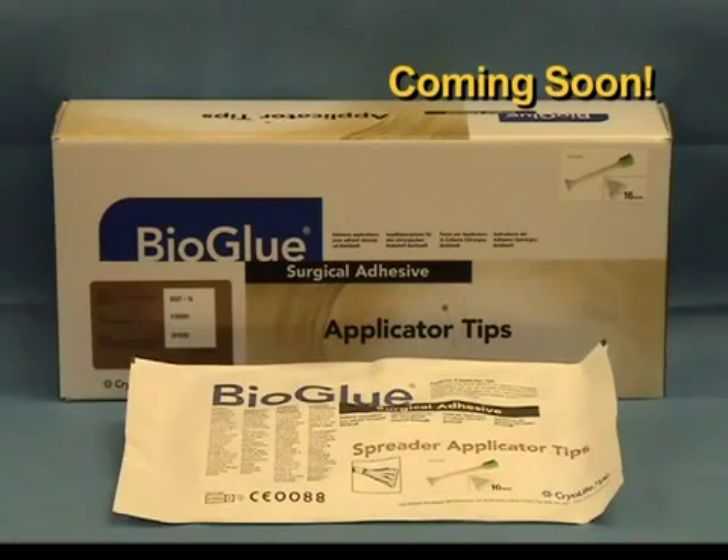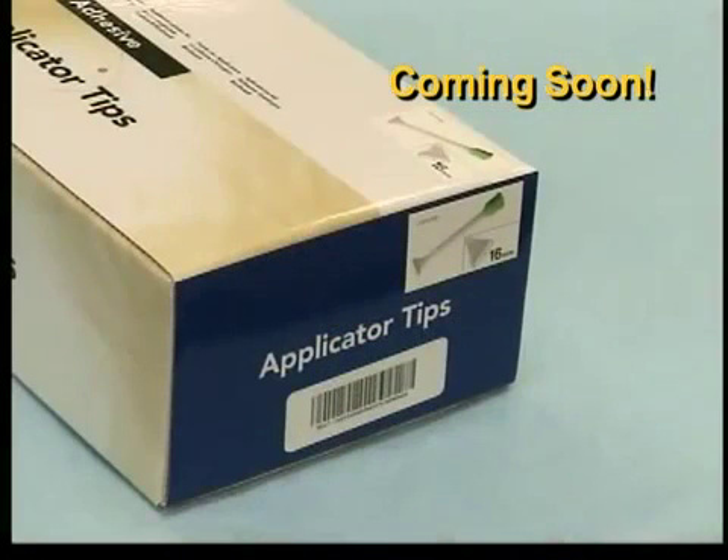Here is the outer shelf box that contains the spreader applicator tips. The spreader applicator tips are available in two different sizes: 12 and 16 mm widths. Note the spreader tip indicator label on the front and side of this box that also indicates the spreader tip width.